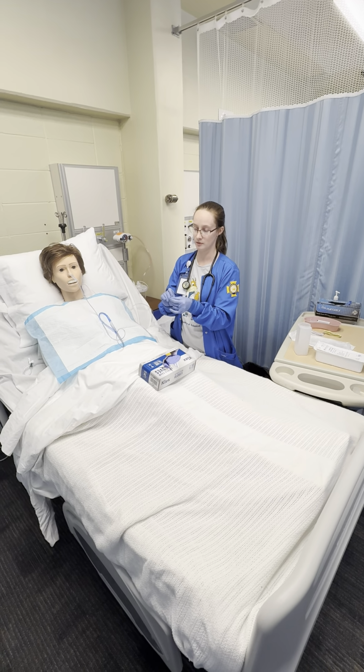So I'm going to go ahead and tear that. I'm going to go ahead and grab the tube so it stays in place. Take that last piece off.